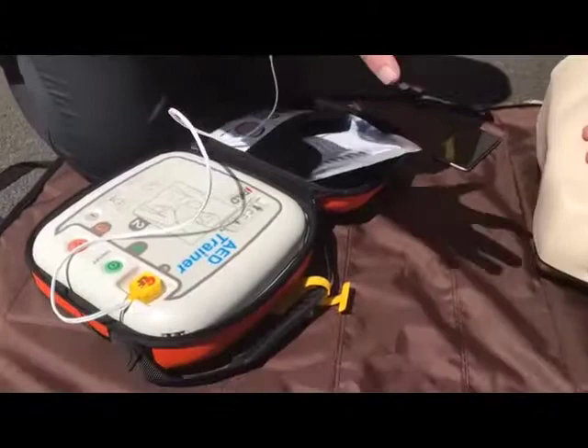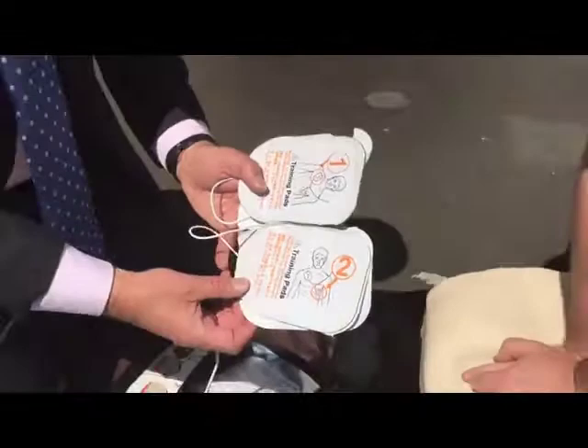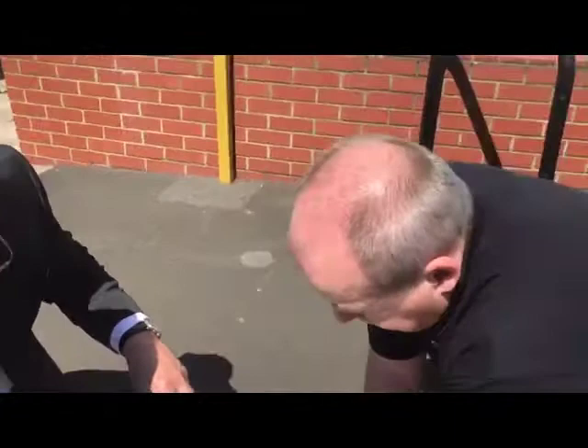Stephen has already removed the clothing. These are adult pads because this is an adult patient — we can switch to pediatric pads if needed. Looking at the pads, it tells us where to put them: pad number one is going to go in the top right-hand corner of the chest.